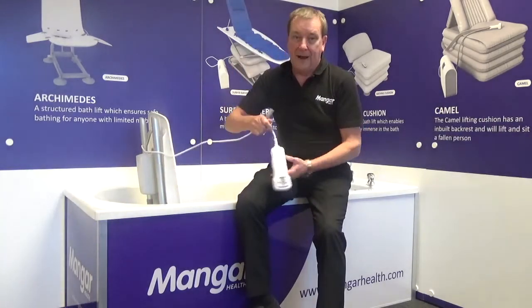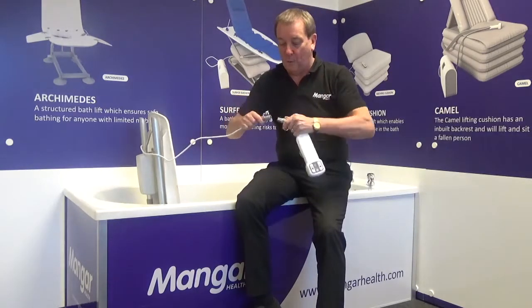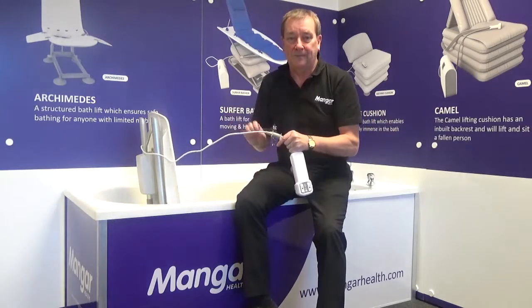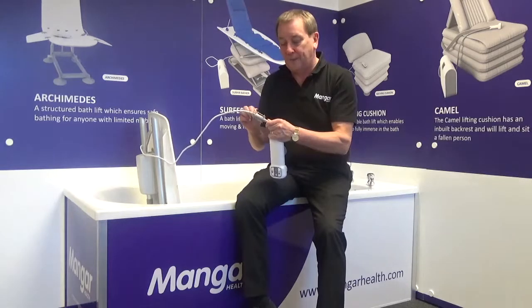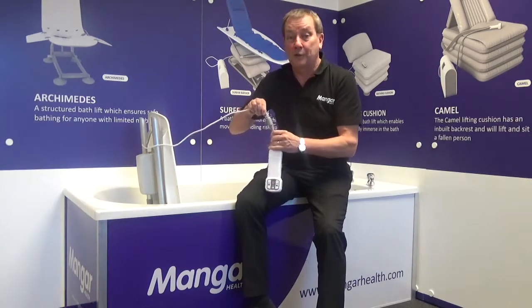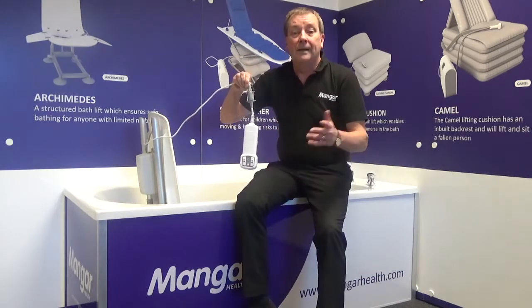So my handset will only go into here one way. I just line it up and turn and it drops into place. Just for when it's attached to the bath lift, we have this extra metal clip, which will just come across here as an extra fail-safe in case you were worried of the 2 pieces coming apart. Next thing to do is have a look how the bath lift works.